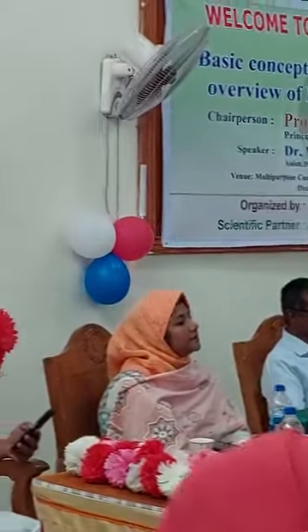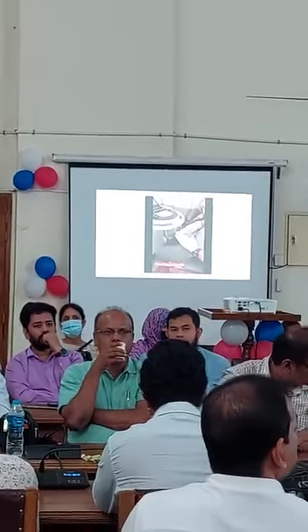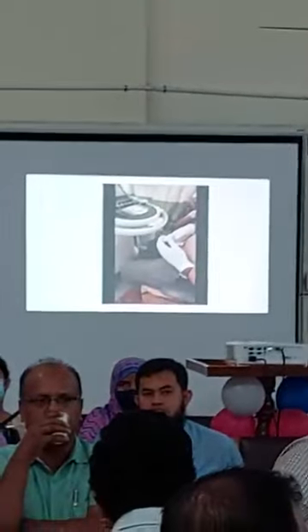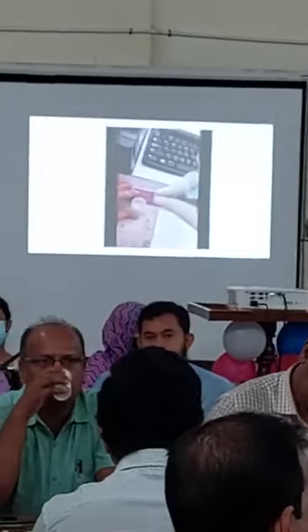So I want to show you a short video clip regarding the collection of a punch biopsy sample for histopathological analysis. Here you can see the punch biopsy. This is a very easy technique for collection of surgical samples without any operation. It's a minor surgical procedure. Before that, we take informed consent. After that, we take proper aseptic precautions and collect the punch biopsy sample.